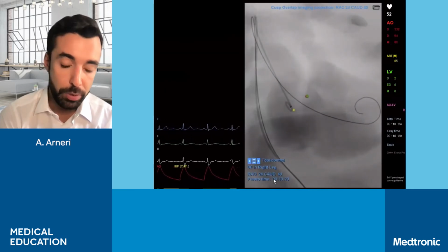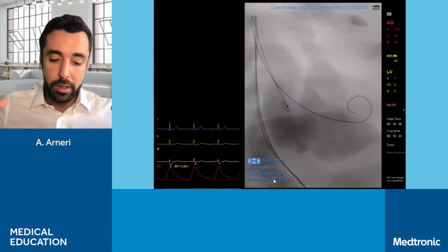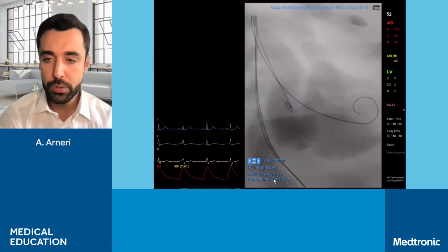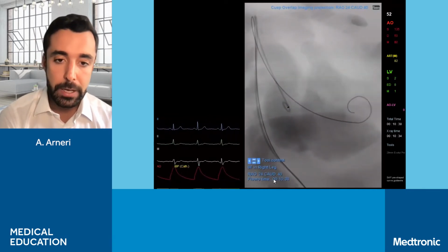It's important, we cannot see it from this simulator, but it's important to insert our device with the flush port that you have on the handle of the delivery system at 3 o'clock. That will help a lot to reduce the risk of commissural misalignment.